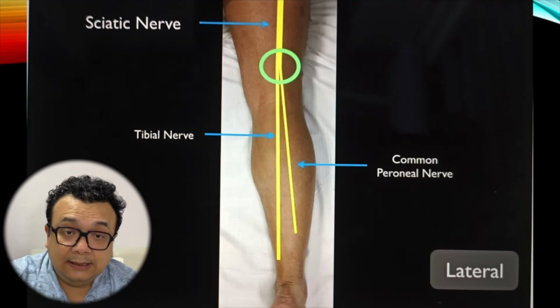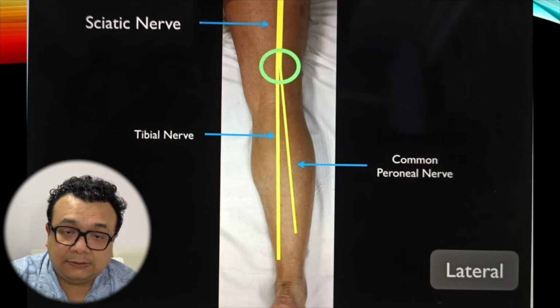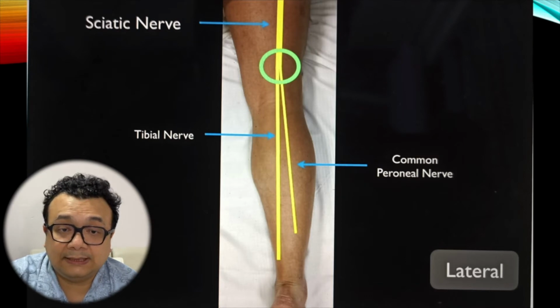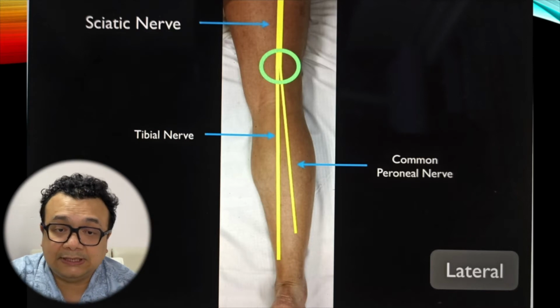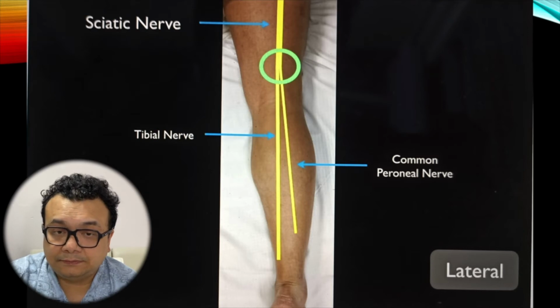Okay. This anatomy shows the sciatic nerve before it reaches the popliteal fossa is divided into two, tibial nerve and also common peroneal nerve, right? So what is your aim of giving the popliteal block is before the bifurcation. Traditionally it's mentioned about 10 centimeters above the popliteal fossa. However, by using ultrasound, it's just above, sometimes about 2 cm or sometimes lesser than that, right?